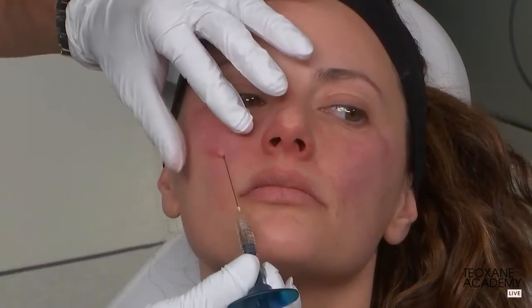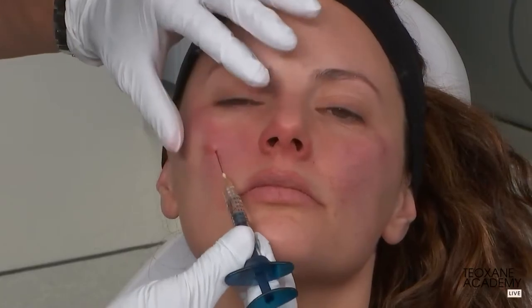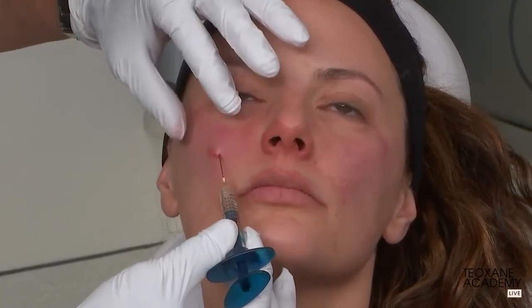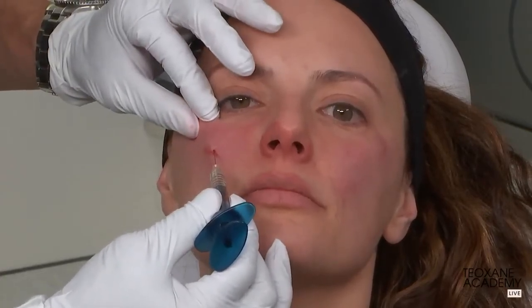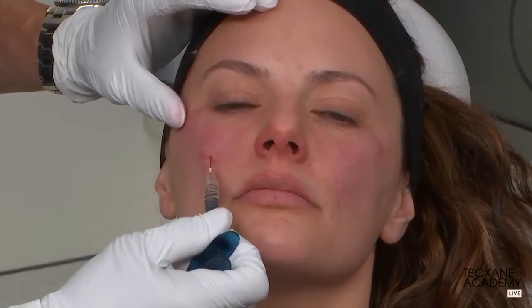and slide outside. That's so painless. Here you are superficial. You can see the cannula right there. She didn't feel a thing. And then here you can pass the ligament, and she possibly didn't feel anything at all. I'm over here, and then up. So, thank you very much.